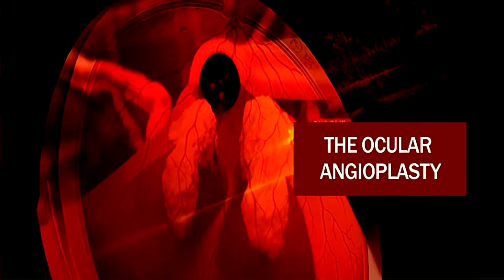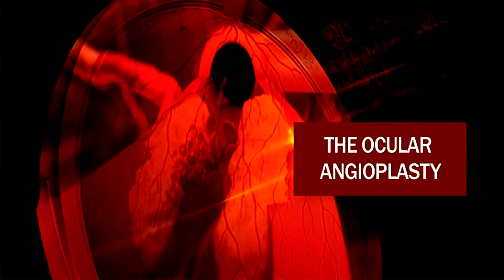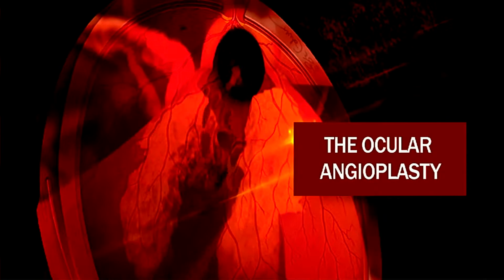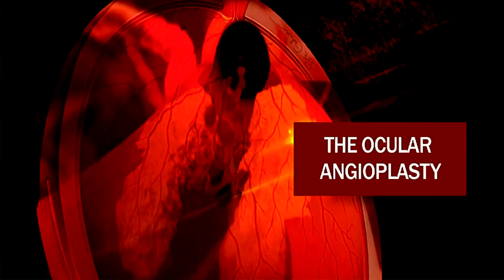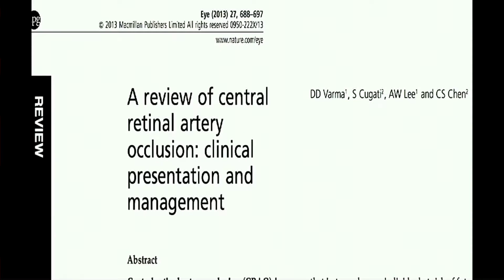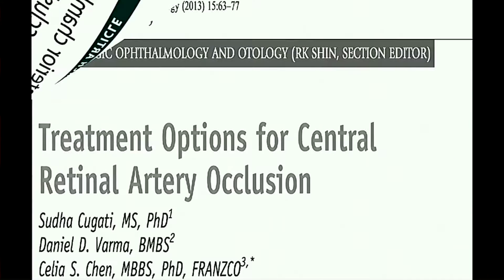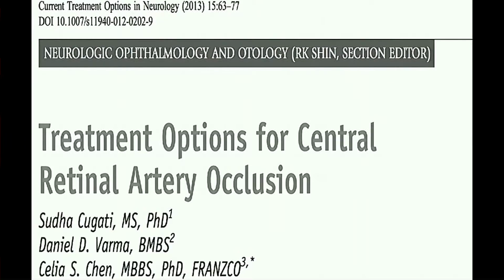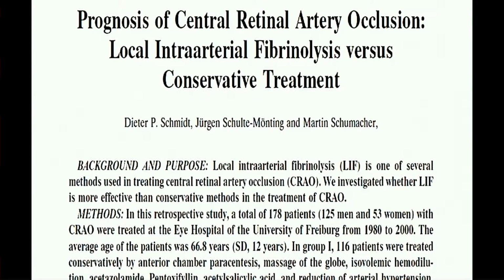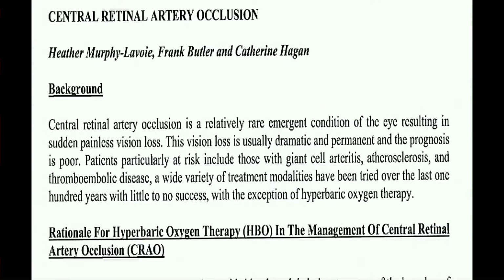Central retinal artery occlusion is an ocular emergency and is the ocular analog of a cardiovascular stroke. It results in profound, usually monocular vision loss and is associated with significant functional morbidity. Hence, usually methods like ocular massage with paracentesis and pharmacological therapies are tried. Studies have however shown that these methods do not show significant amelioration for most patients. The same was the case with this patient.